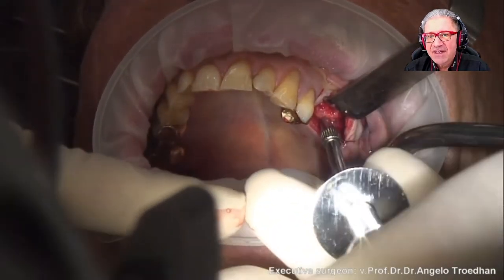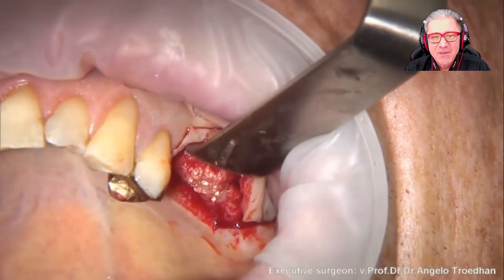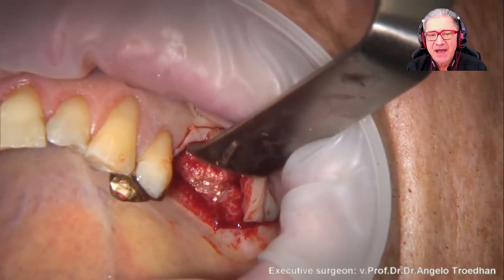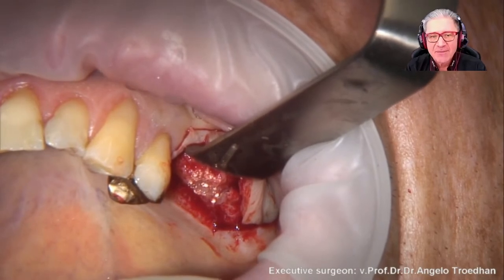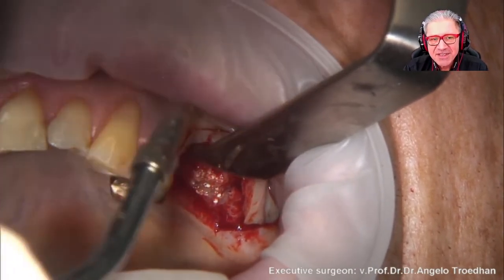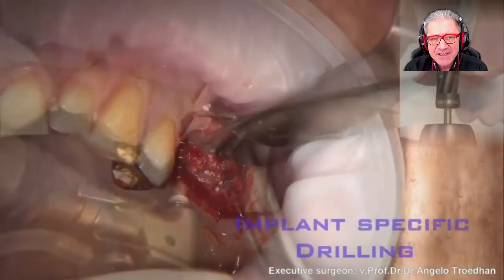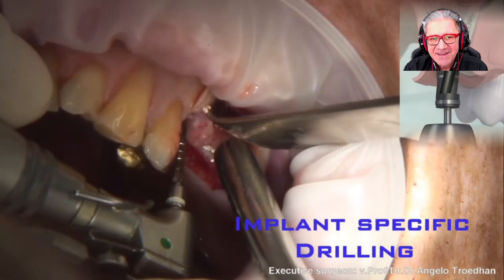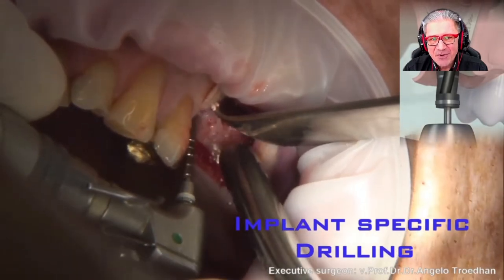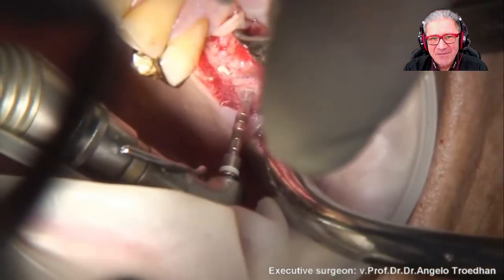Of course, now in the next step, we apply the bone graft material. And in case of our study, it were 4 different types of bone graft materials, because we wanted to know about the biomechanical properties of different types of bone graft materials. And as you can see, it's just a very, very small crestal flap. And it's just an approach, a transcrestal opening of 2.8 millimeters.